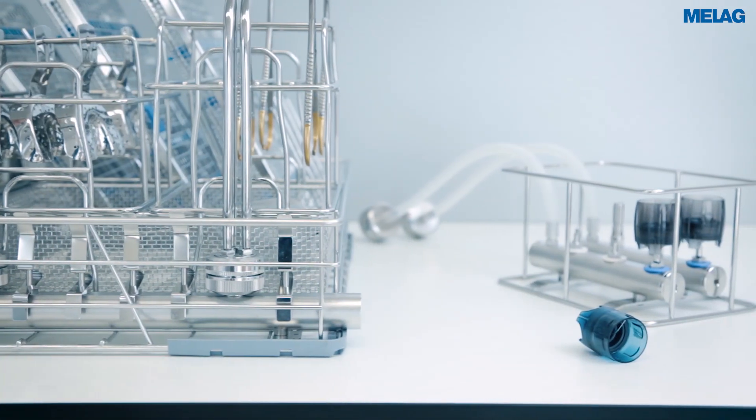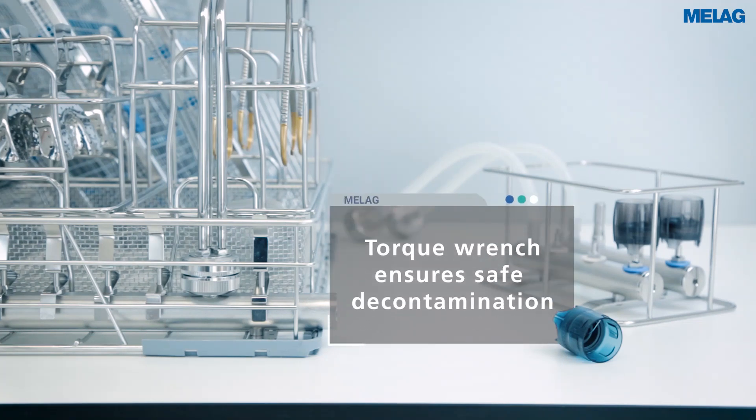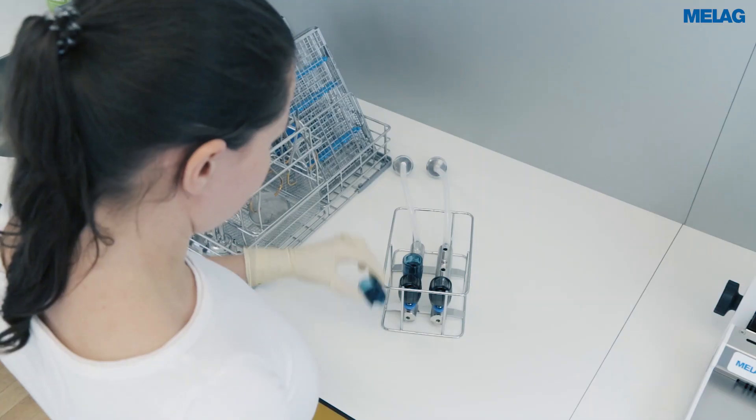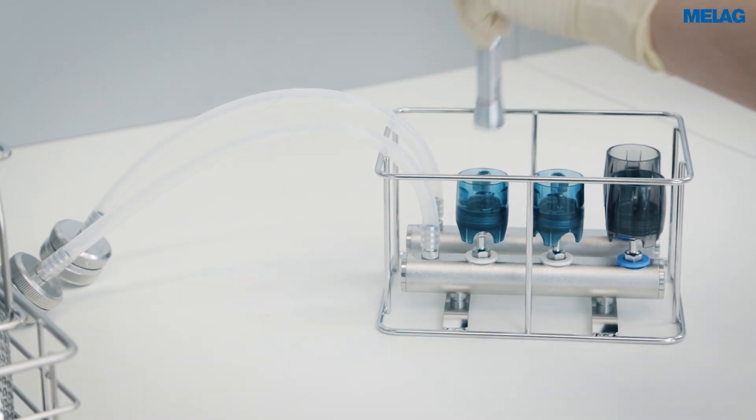You can connect ultrasonic scaler tips safely using the torque wrench. The injector basket Flex 1 provides a space saving solution for the decontamination of ultrasonic scaler tips and further hand pieces.